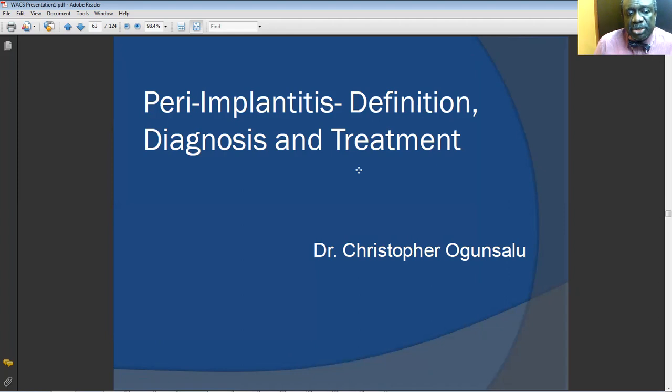I'm going to say to you that peri-implantitis should actually not be called peri-implantitis. It should be called peri-implantoclasia. The reason is implants are not tissues. Implants are metal.